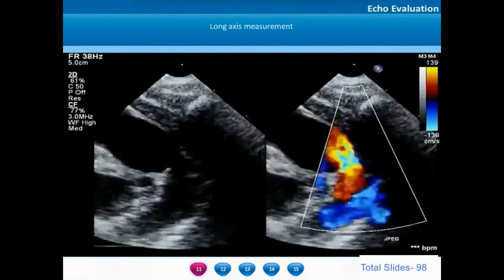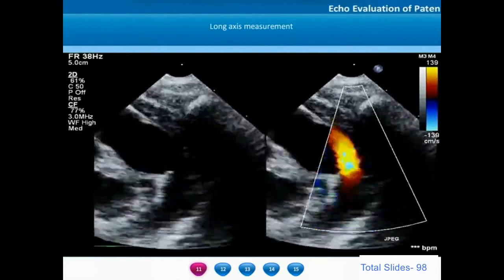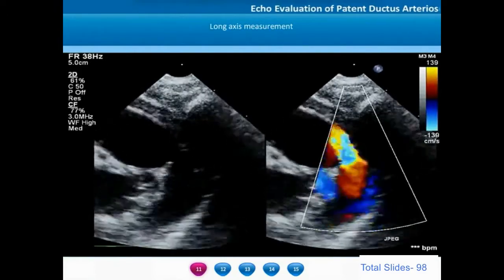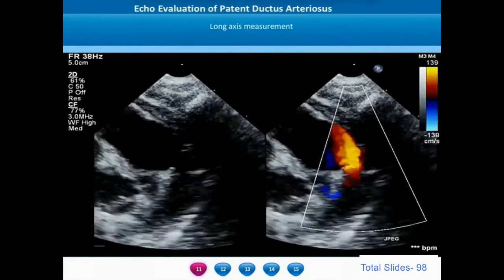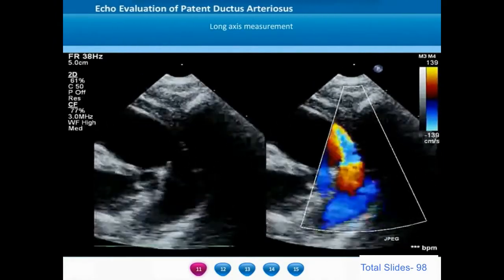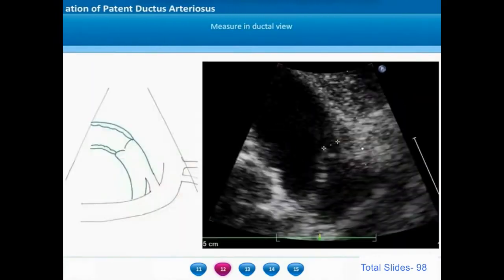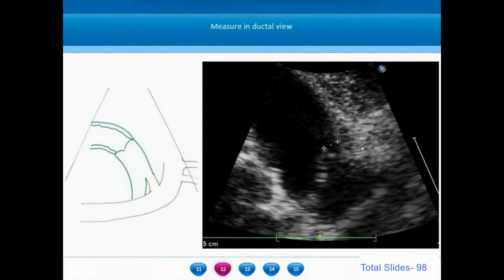Once we get this view, we freeze the frame which has the maximum size of the ductus and then measure it. This is how the ductus is measured at the pulmonary artery end — cursors are placed on either end of the ductus in this ductal view and the measurement is taken.